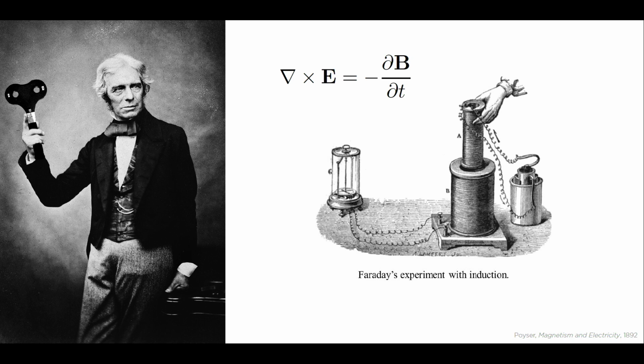And the winding A is moved rapidly in and out of another spool of wire labeled B, which then generates an electricity in that loop of winding, which you can then measure using a meter. So the analogy would be that this canister that generates the electricity is the stimulator, the spool of wire A is the TMS coil, and the head is B.